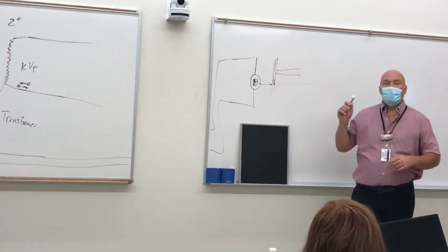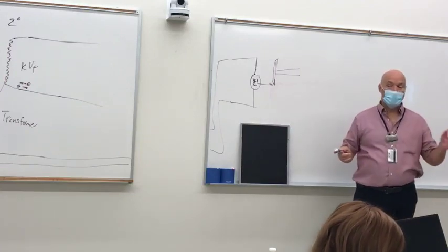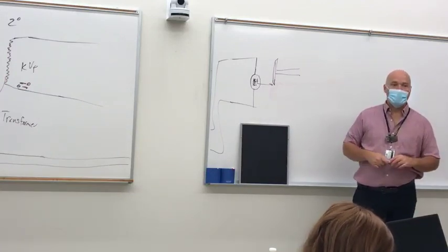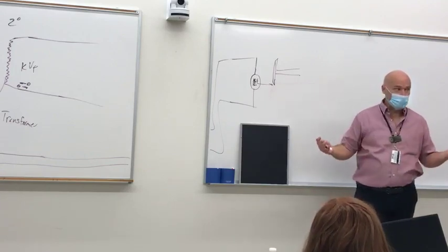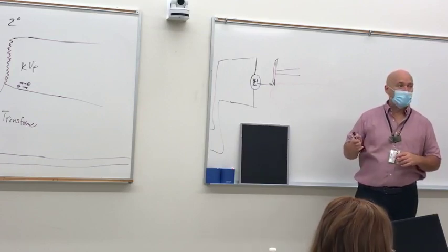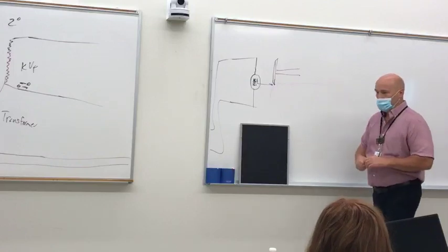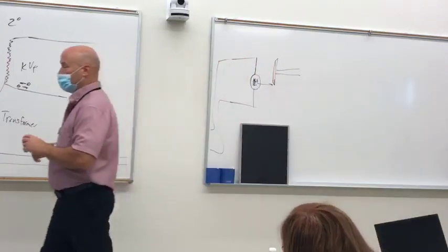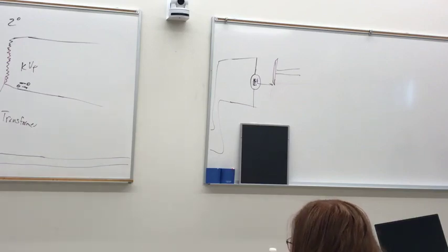So it gets hot. The main thing that we create in an X-ray tube is not X-rays, it's not light, it's heat. We don't want it. We want to get rid of it the best we can. The main thing that will destroy an X-ray tube is heat, but the main thing we create in an X-ray tube is heat.